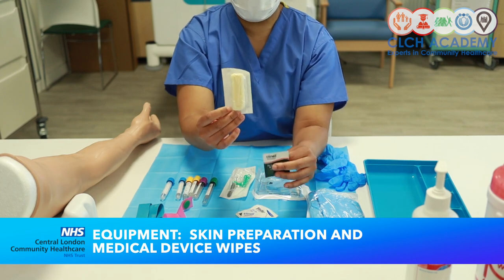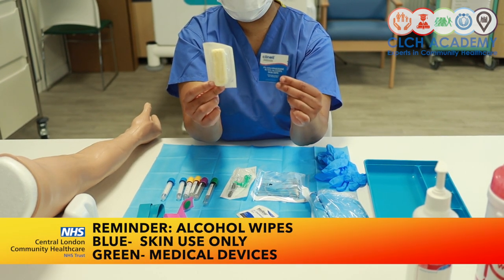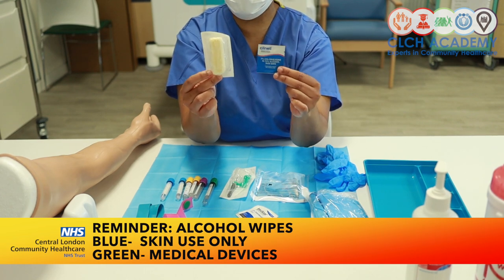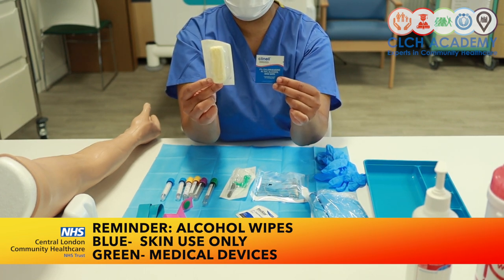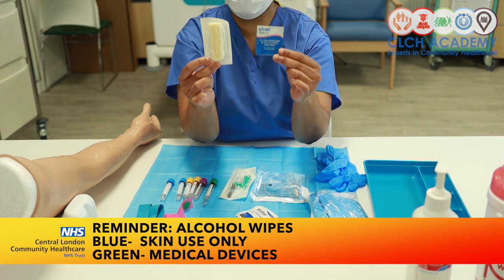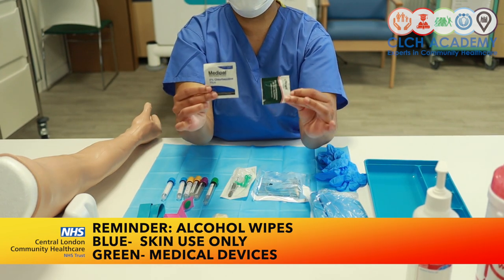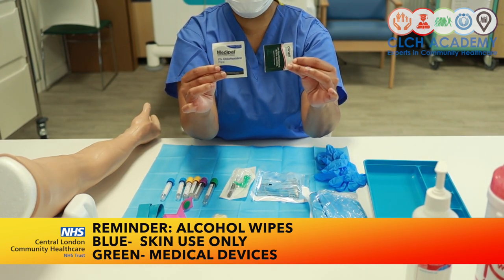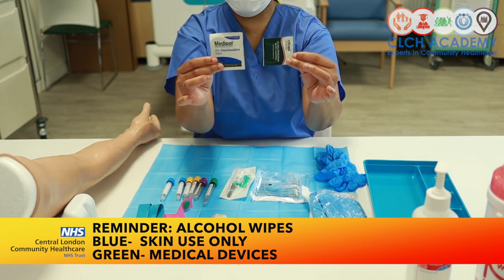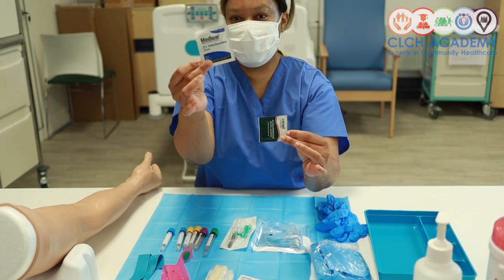So if I can highlight first and foremost, these two would be licensed for skin use. They contain 2% chlorhexidine and 70% alcohol. But these are licensed for skin use only. These two contain 2% chlorhexidine and 70% alcohol, licensed for medical device use only. This one we can add as a bonus for clinical surfaces as well.